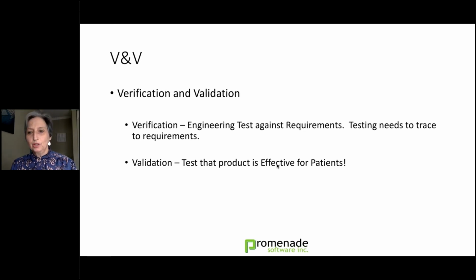The engineers can go off and design to your requirements. They can do a perfect job of it. The engineering does exactly what you said in your requirements, but it could be that your test doesn't work, or somehow your ventilator doesn't work because you're using a new technology, perhaps, and it needs to work is the bottom line. So just want to emphasize that, because these are two important pieces, verification and validation of the device.